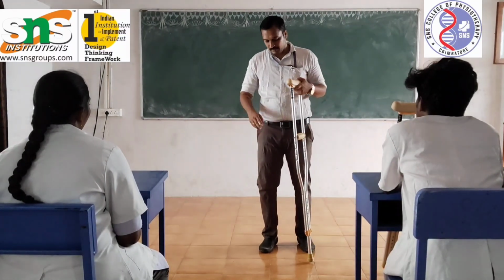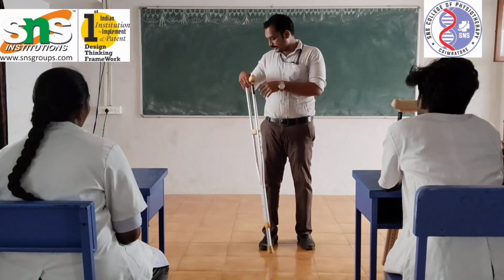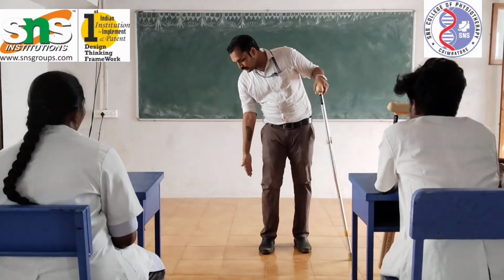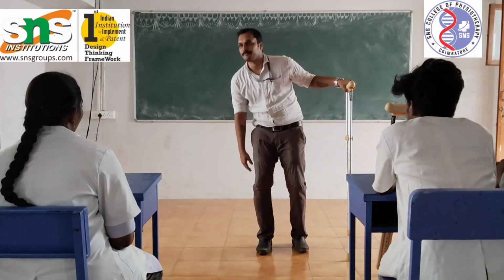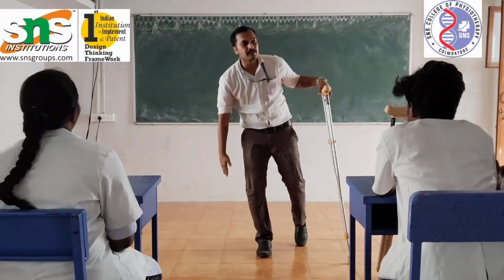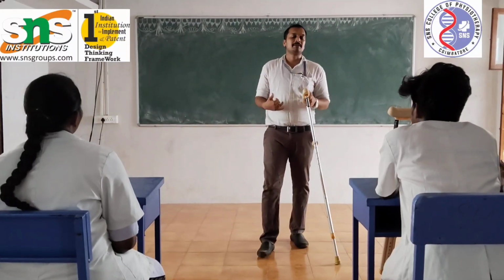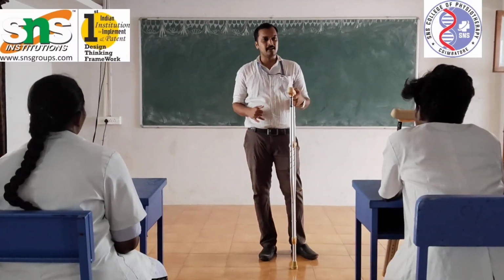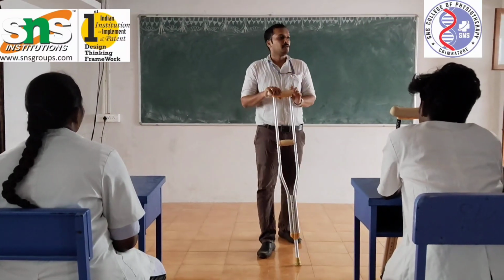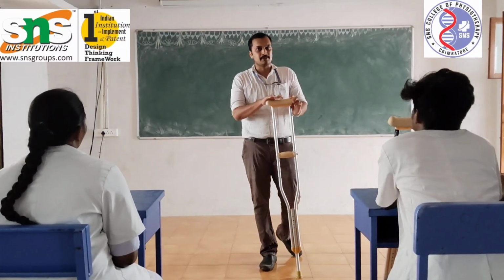Now, how do we measure? We measure the same way, from 5 cm below the axilla, but here we have to take 20 cm away from the feet. We measure from the axilla to 20 cm away from the feet. So this will be the measurement for an axillary crutch in standing, in both ways: shoes on and shoes off.